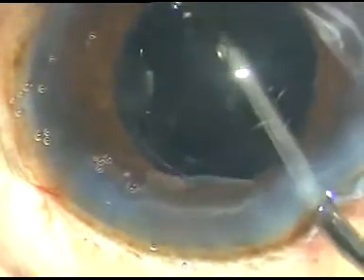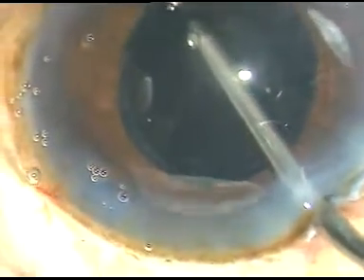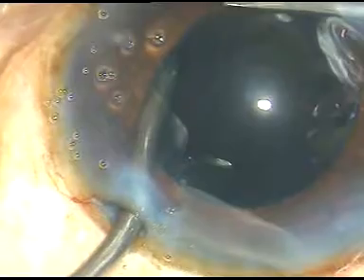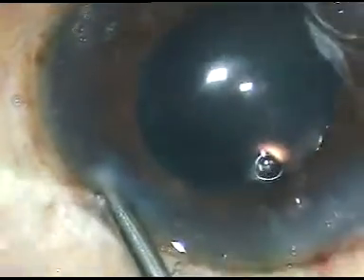And now I remove the viscoelastic substance. I have used Simcoe cannula first, have removed a portion of the viscoelastic substance. Now this is bimanual IA. I am removing the rest of the viscoelastic substance, HPMC, what was there, and thorough cleaning of this viscoelastic substance is very important. I use at least 1.5 minutes to remove the viscoelastic substance thoroughly. I don't want to see raised IOP next morning.